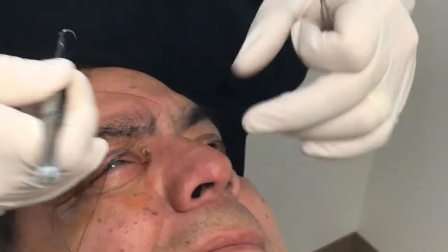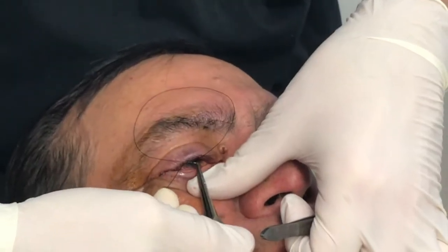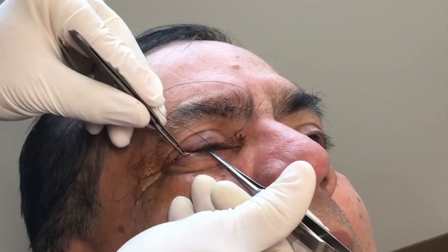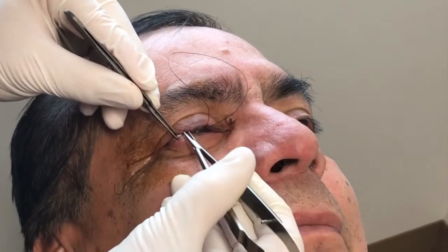You can use a 4-0 silk in a single-arm fashion. I typically suture the central centimeter of the upper lid to the lower lid, passing your suture needle through the meibomian gland openings. This provides strength and integrity to your temporary closure, and I often will place four square knots to try and keep it from coming apart with repeated application of medications to the ocular surface.